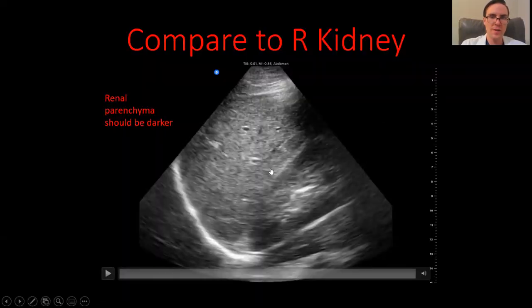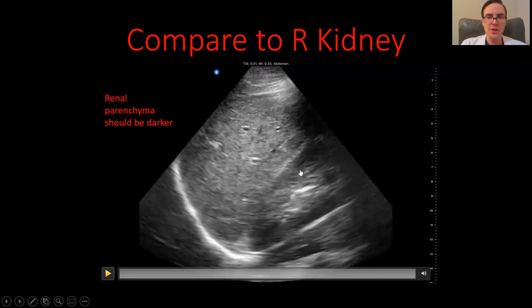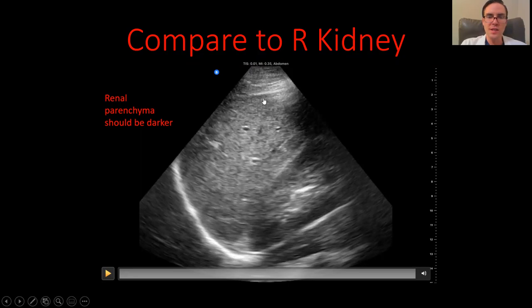First we're looking at echogenicity and comparing it to the right kidney. As you can see, the kidney is here with a dark ring around a lighter echogenic core — the parenchyma has less echogenicity than the liver. The liver is here, and the more ultrasound you do you'll come to recognize this characteristic architecture of the liver — these little holes you'll see in a granular background field. Once you recognize that consistency, no other organ really looks quite like it, so it's very helpful to always know exactly what you're looking at.